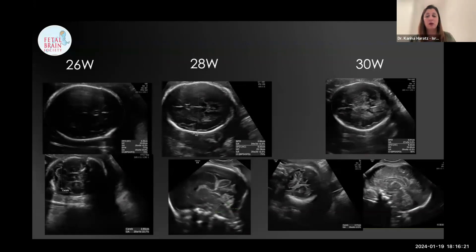The TCD was about the 15th centile, but the biometry of the anteroposterior diameter of the pons and the height of the vermis were small by this gestational age, but we didn't diagnose that because morphology was so good that we didn't measure it then. By 30 weeks, the head was still super small, almost did not grow, and then the TCD got small.